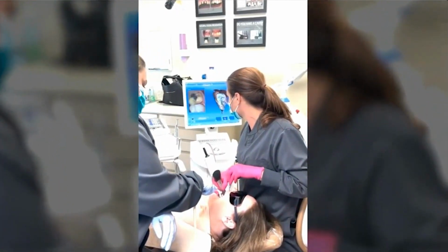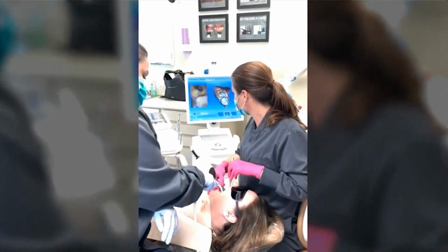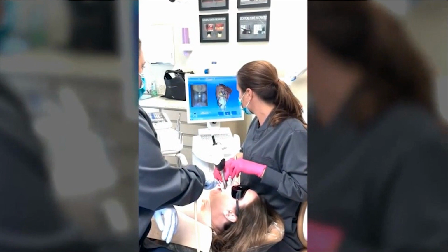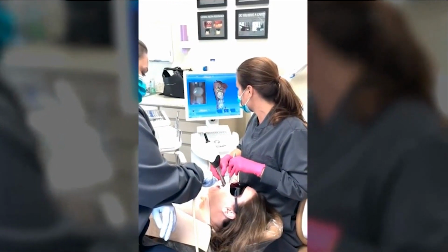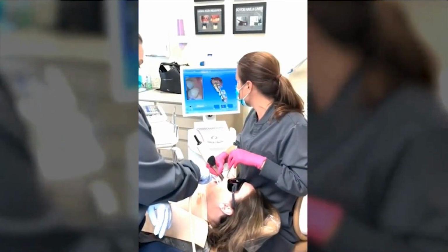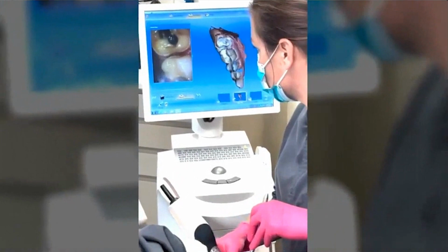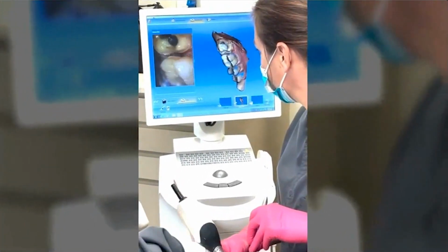I'm not stretching the patient wide open to try to get back there. It's very easy to get the intraoral camera in there. It's nice and sleek and small, so you don't have to choke your patient or make them uncomfortable at all to be able to get that scan. So what I'm doing is just scanning the upper right now.